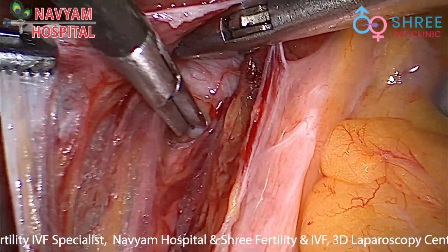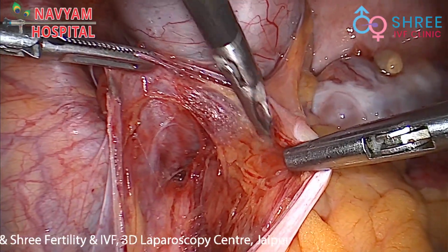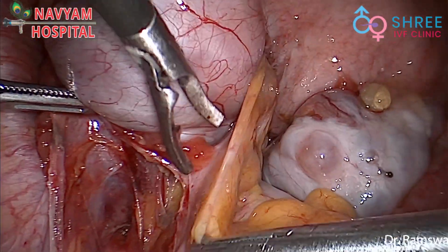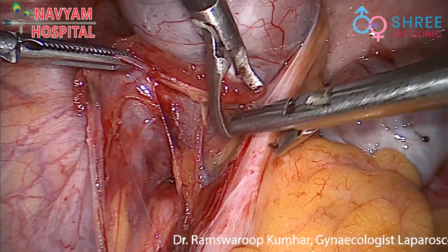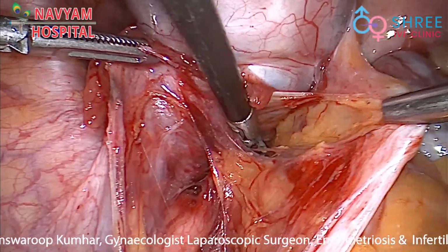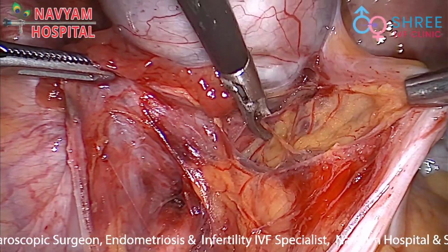Later on, the sigmoid was mobilized away from this tubo-ovarian mass, and we did not puncture the TO mass because the cystic mass will provide us good traction and counter traction.